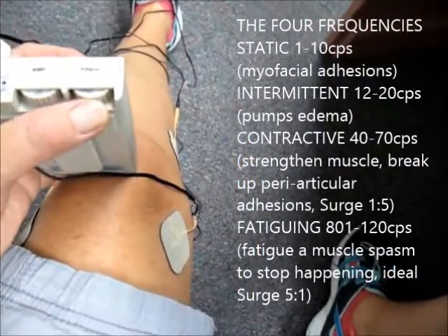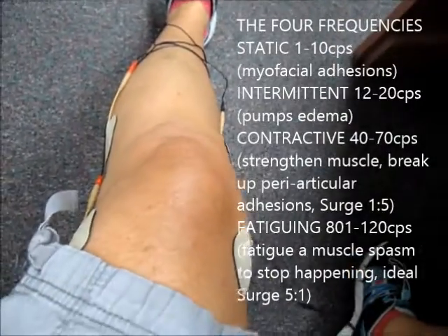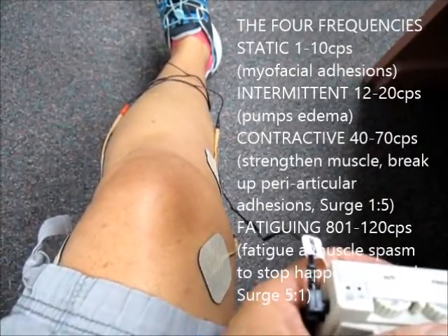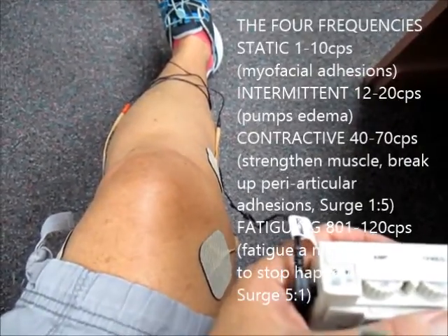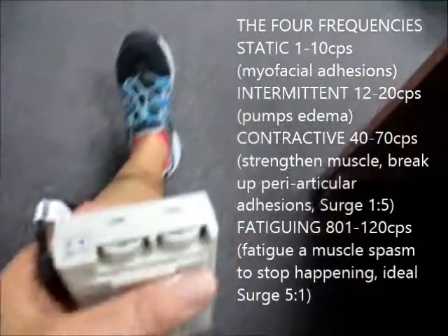And then the last setting is for fatiguing. This particular one I was using just to demonstrate how to set up around the knee. I also want to show fatiguing on the popliteus because that's a frequent cause of knee pain. And so that's a quick review.